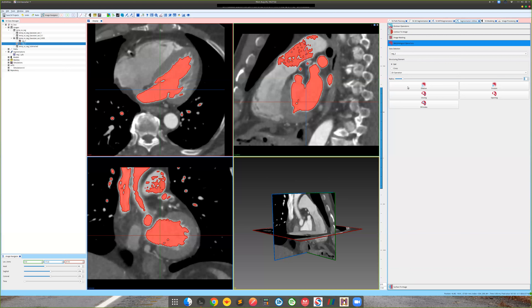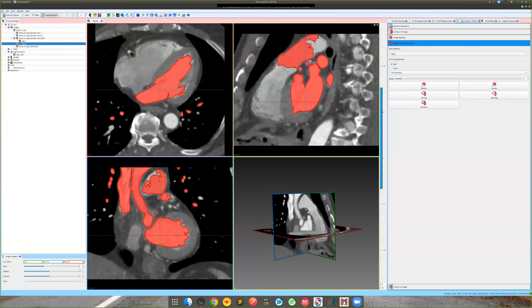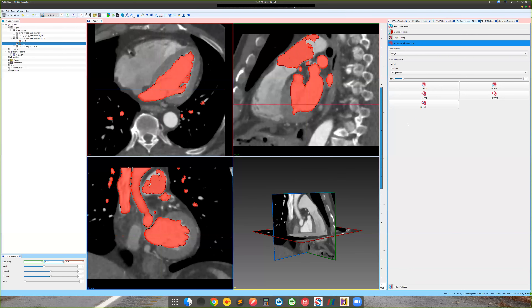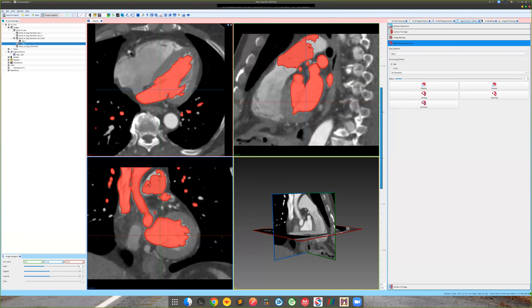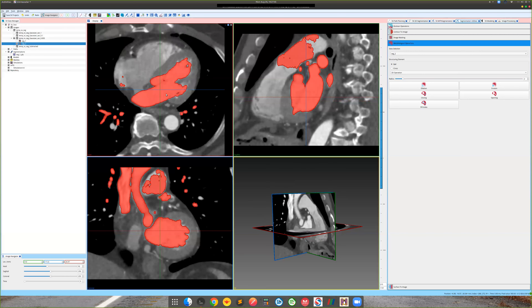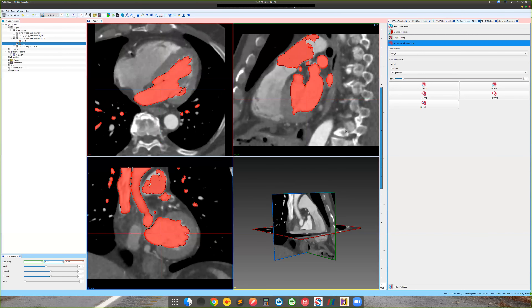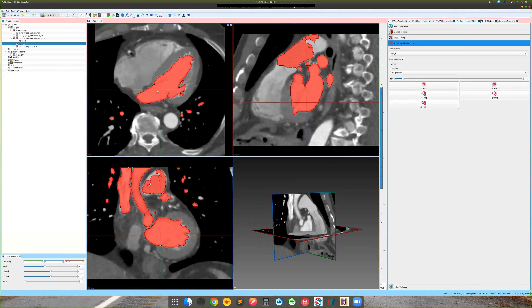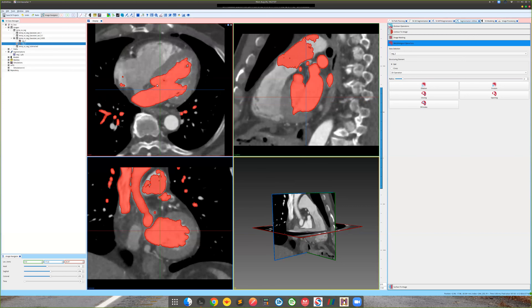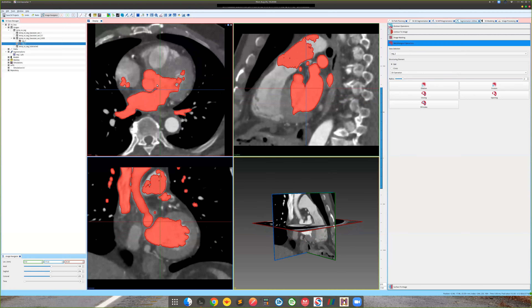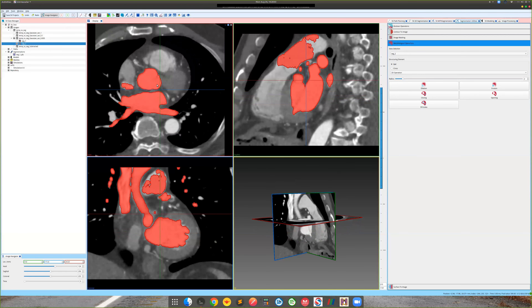Let's apply the Dilation operation on this segmentation. Now you can see most of the holes have been filled and the borders are more exactly covered. However, for those interested in valve segmentation, I'd recommend against these operations — the mitral valve that was nicely resolved in the original image is now gone after dilation. That's a negative aspect of these tools, but if you're not interested in valve detail, this tool is still useful.